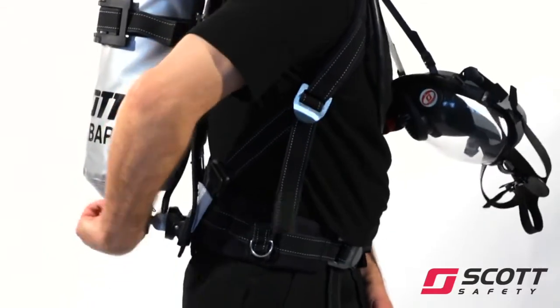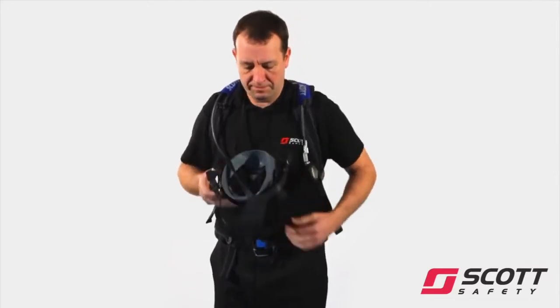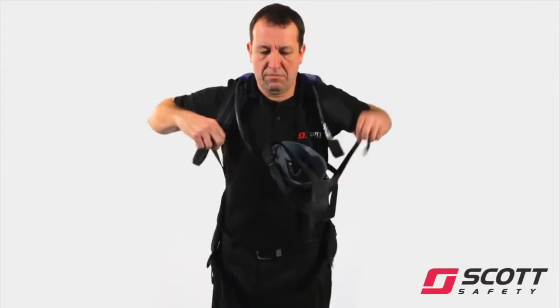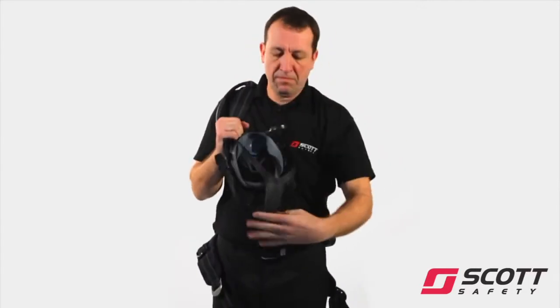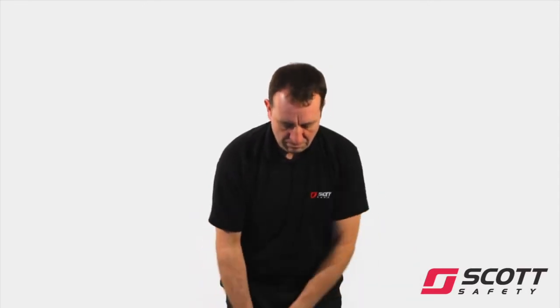Close the cylinder valve. Open the DV bypass knob. When airflow stops, turn bypass to off. Release the waist belt buckle. Slacken shoulder straps by pulling up the metal buckles and remove the apparatus. Clean and check the apparatus prior to being returned to service.